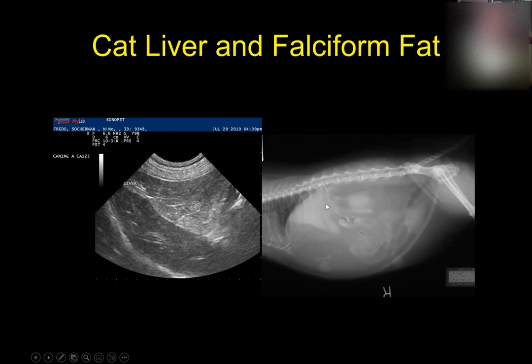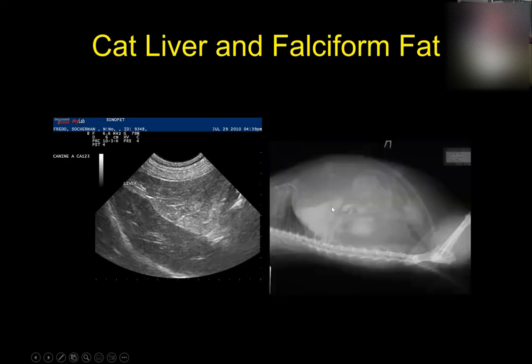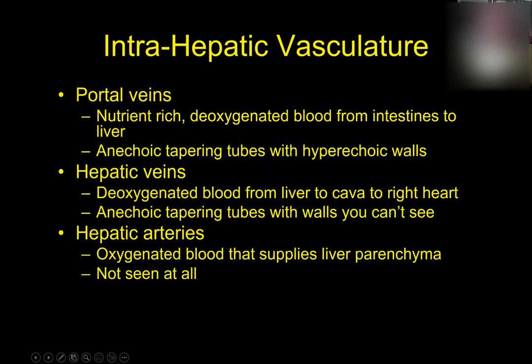So here it is. And again, with ultrasound, ventral is this way and dorsal is this way. With radiographs, we look at them head to the left always, but now with radiographs, ventral is this way. And so if you get confused, you can just kind of flip the cat over and now it makes sense. So there's liver here, there's liver down here, here's fat up here, here's fat up here. Okay. So that's how they kind of correlate. So, big old fat cat. Okay, the intrahepatic veins. Now let's talk about them. We said, number one, the veins should be very prominent.